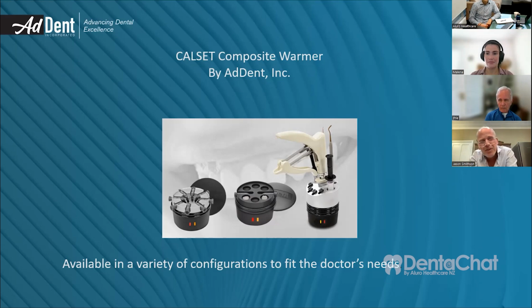If sometimes you get a little tiny defect, we can just infill with a little bit of heated composite, or perhaps even a little bit of flowable. But that's another application I use it for. So yeah, I use it a lot, basically. I can tell that.